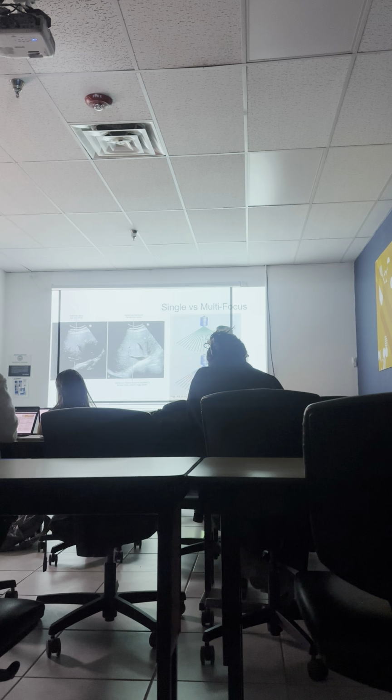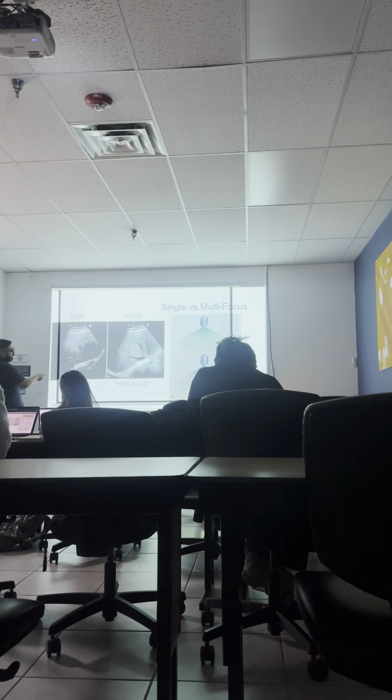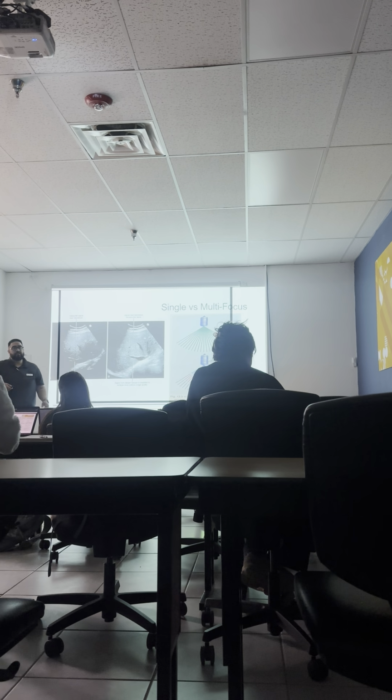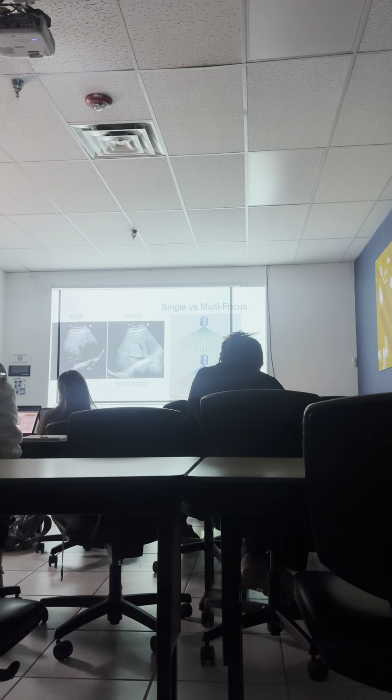Okay, so maybe we could say here that our focal point was right here, right? Because we can see this pretty clear. Past that, we can't see anything. So this tech added a focal point here, a focal point here, and a focal point here. So now we see the entire liver. Okay, does that make sense? Yes, sure. Paul? I think I get it.